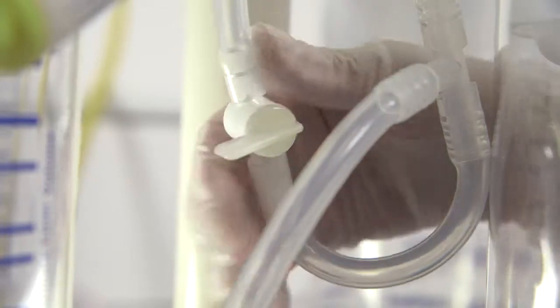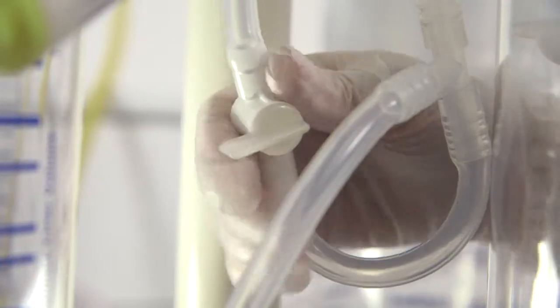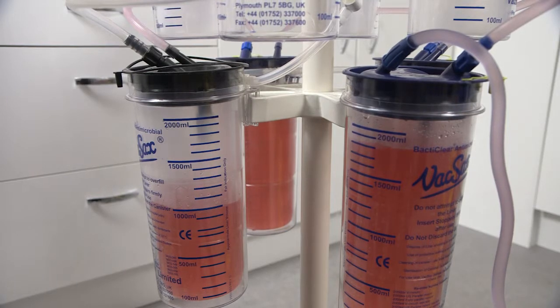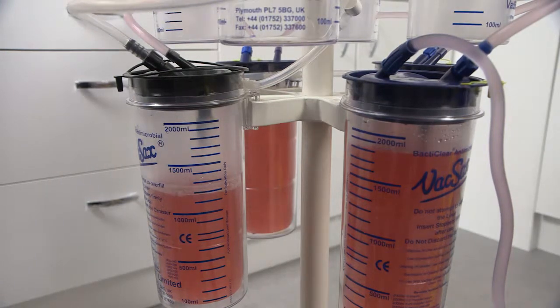Open the top siphon tap and the liners will inflate into the canisters themselves. Once the liners have inflated, close the top siphon tap. Please note that the black lid liner will only inflate once the vacuum has been connected to the vacuum port.